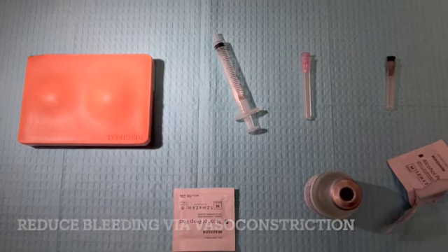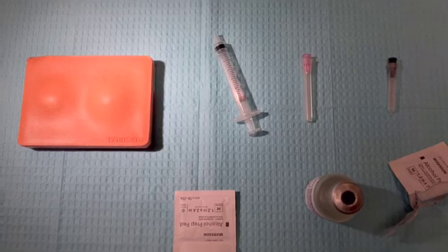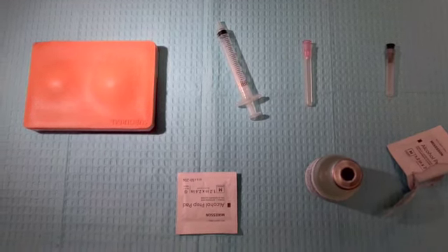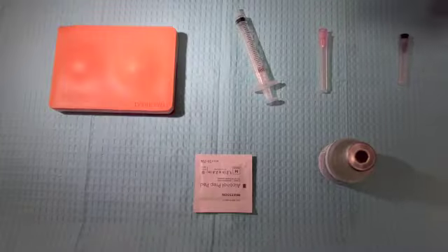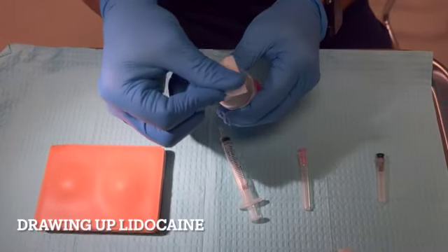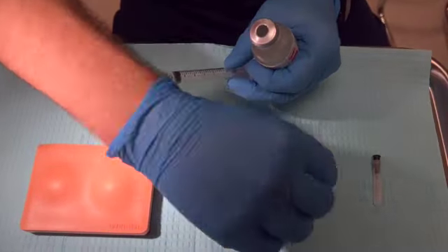One thing with the use of epinephrine, you just want to be cautious of where it's being injected so that it's not in a dead end area, in order to eliminate or reduce the risk of vasoconstriction and potential tissue necrosis from that vasoconstriction. To draw up our medication, because this vial can be reused, we're going to first use an alcohol pad. We want this to be dry before we insert the needle.